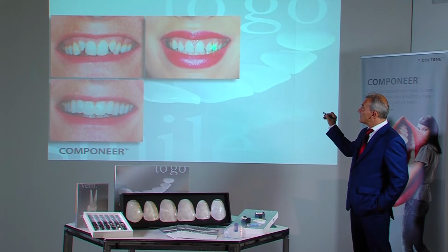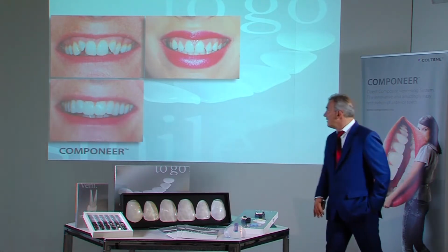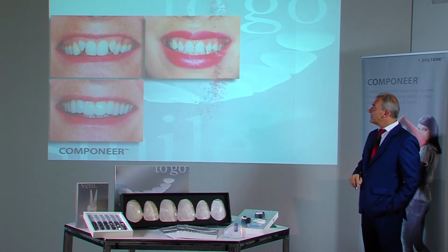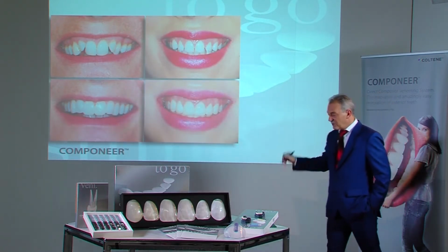Here again we have the contrast points, the interdental gaps, the triangles. One imagines how the tooth profile would look without this gap. In principle, the line is correct and is harmonized to both the lower and upper lip.